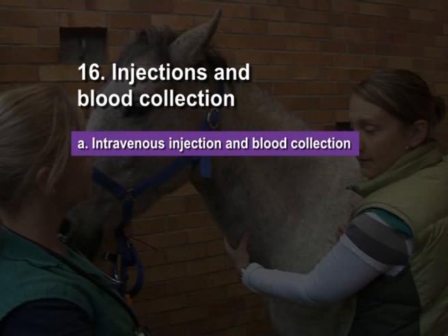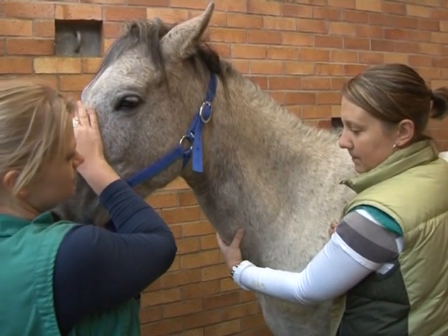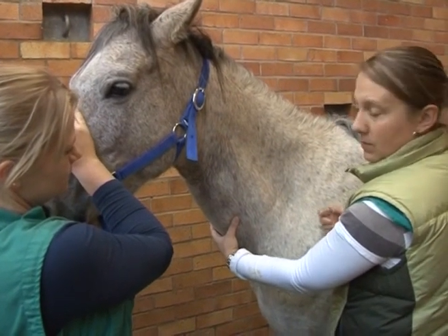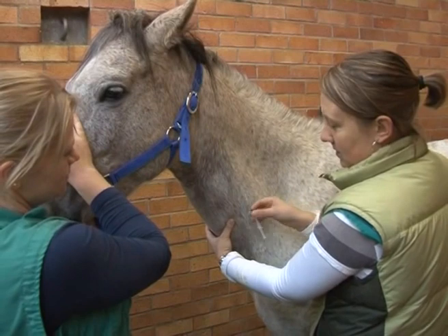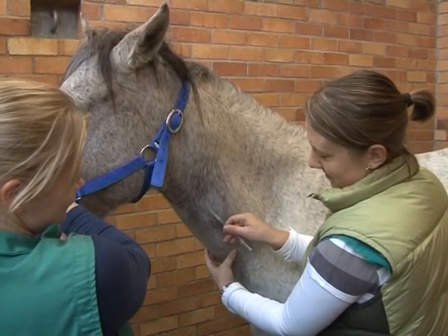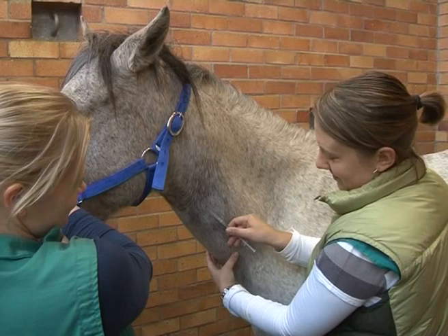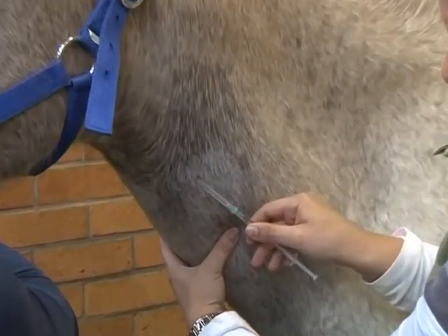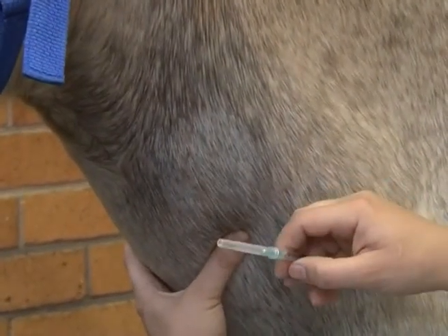Intravenous injection and blood collection. The horse is restrained by a halter. If the area over the vein is grossly contaminated, it should be cleaned prior to venipuncture. The location to collect blood and inject into the jugular vein is in the upper half of the neck, to prevent inadvertently puncturing the carotid artery.